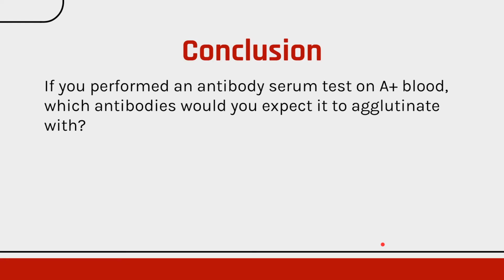If you performed an antibody serum test on A positive blood, which antibodies would you expect it to agglutinate with?